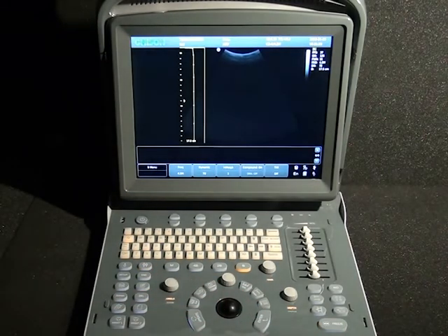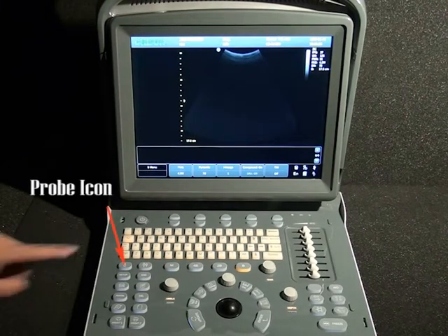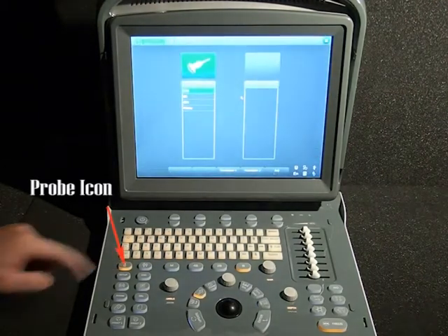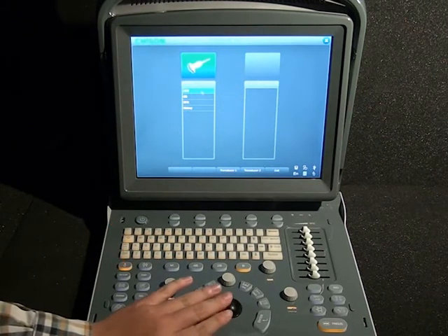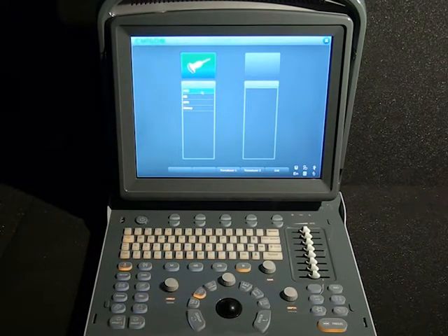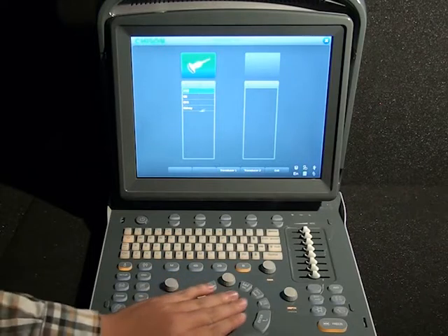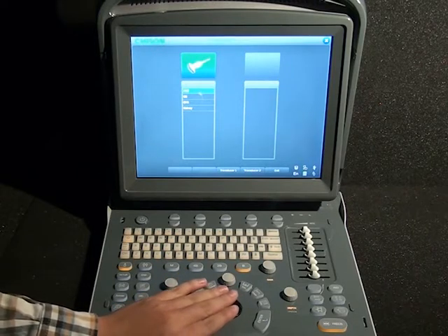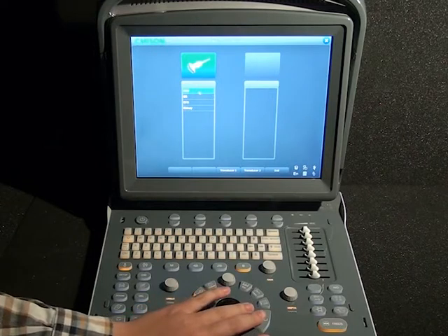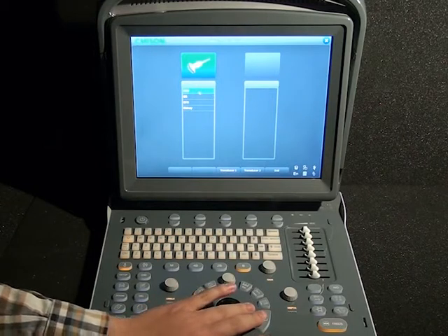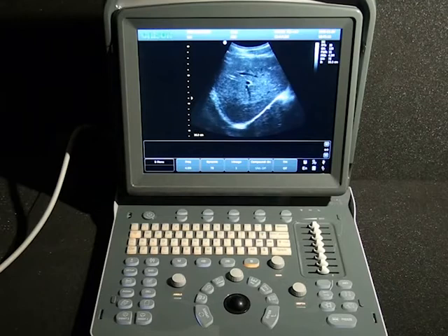Now to start the exam, we are going to select the probe icon. This is the main exam — two probes are available, and each probe has several presets. We are going to choose the abdomen preset; click on abdomen or whichever exam you are going to do. Now we are in B-mode.